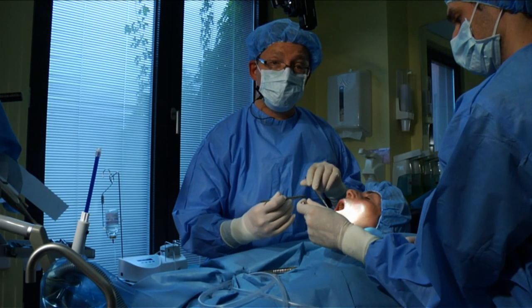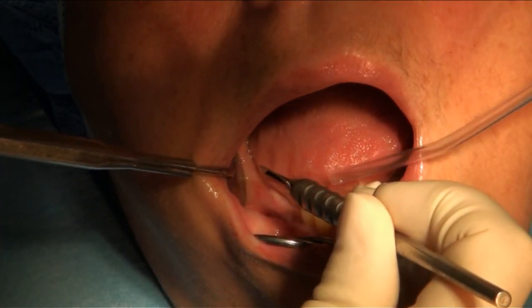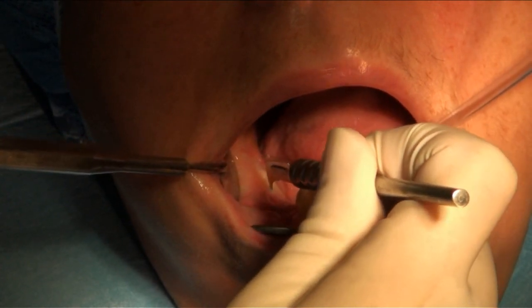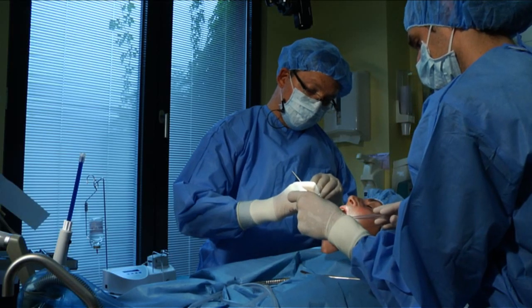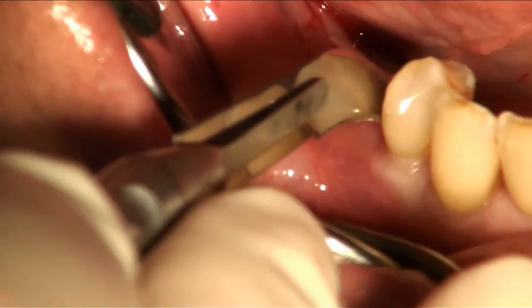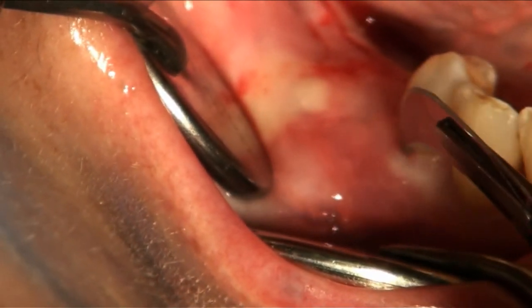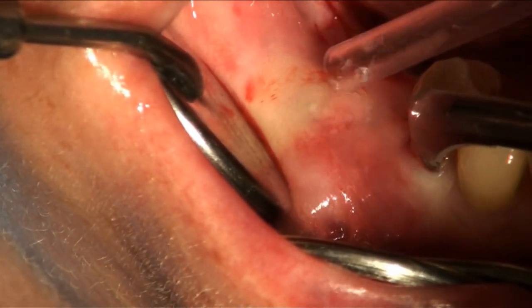Okay, our first incision goes in the middle of the crest, mid-crestally, within the keratinized tissues. So we will stay a little bit aside from the position of our expander in this soft tissue. Now the sulcular incision around the anterior tooth, adjacent to the dentulous area, and in front of this next tooth I will put the releasing incision.